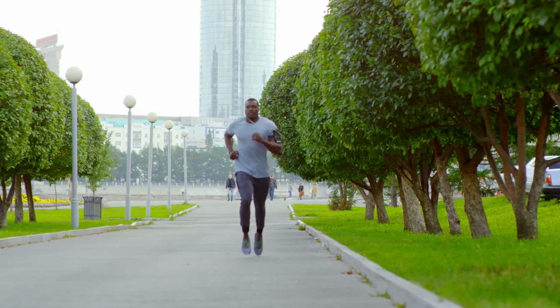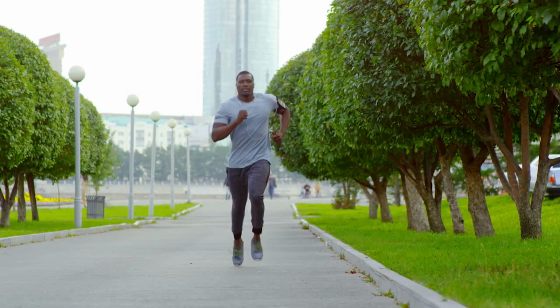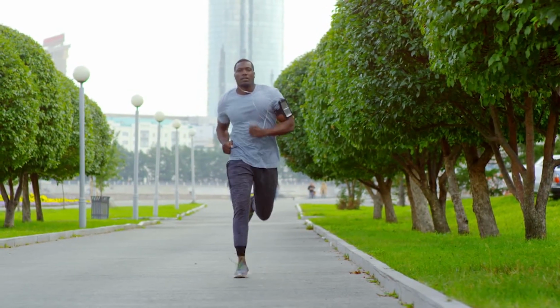The first classification will be based on the measured parameter. The first one will be vital signs monitoring. Wearable sensors that measure parameters like heart rate, blood pressure, respiratory rate and body temperature fall under this category. The next one will be activity and movement tracking. Sensors that monitor physical activities, steps taken, distance travelled and posture fall into this group.